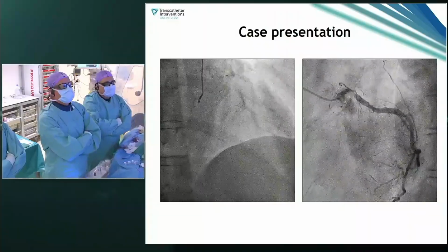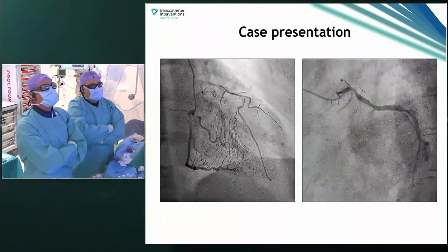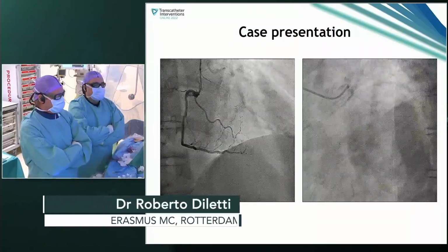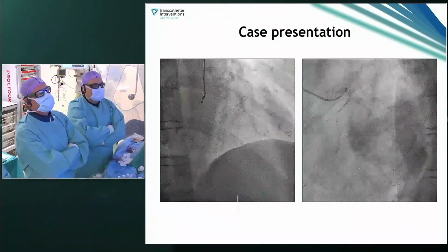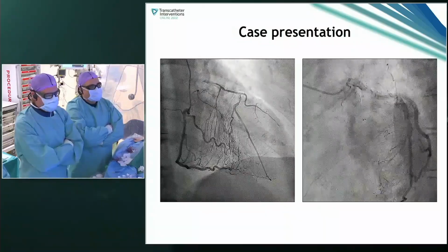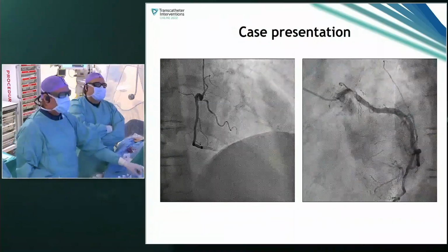Yes. So this case was going to be discussed in our team because, as you can see, it's quite a complex case. But the patient, after this angio, became unstable again. So we had again a discussion with the referring hospital, and we decided to get the patient rid of complaints, stenting the left main.